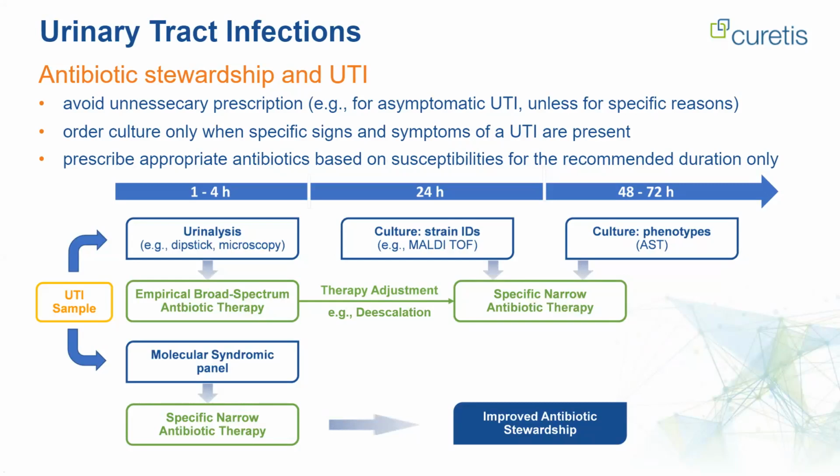Secondly, due to the high sensitivity and specificity of the molecular panel, it could detect pathogens that traditional culture might miss, especially in the case of fastidious or slow-growing organisms. Therefore, this quicker and more accurate identification allows for a faster and more targeted antibiotic treatment. This will potentially improve patient outcome and support antibiotic stewardship.